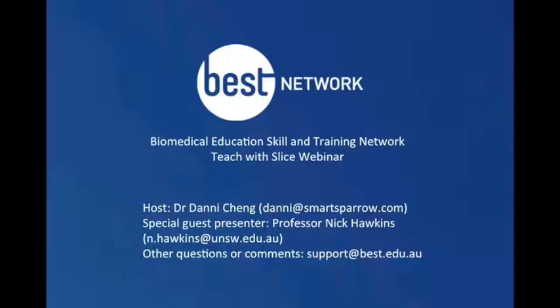We have our special guest and the Best Network lead, Professor Nick Hawkins, who will be sharing some of his experiences about creating learning activities using Slice. This webinar is designed to provide support and insights for existing and new Best members who would like to or have been teaching their classes with images. We would like you to take full advantage of the tools and resources on Slice to enhance the teaching methods.